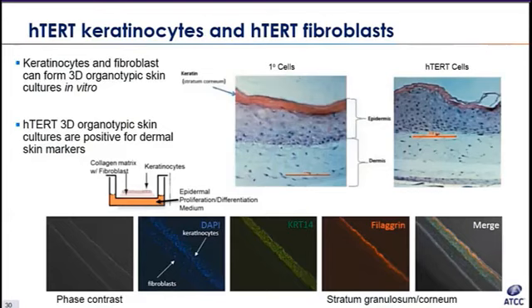hTERT immortalized and primary keratinocytes differentiate into similar stratified epidermis architecture.